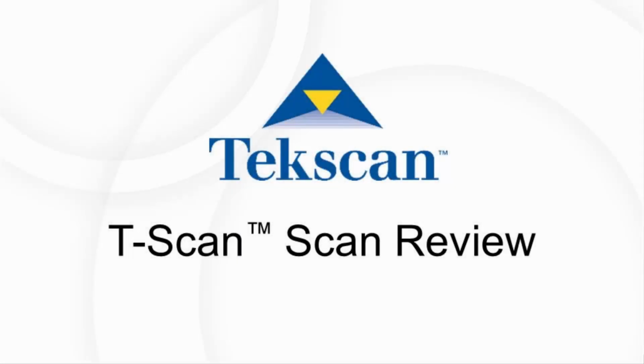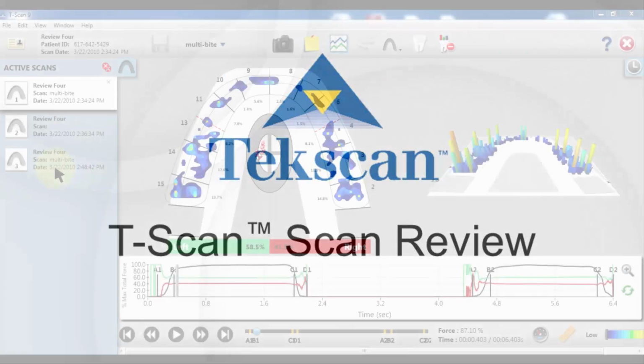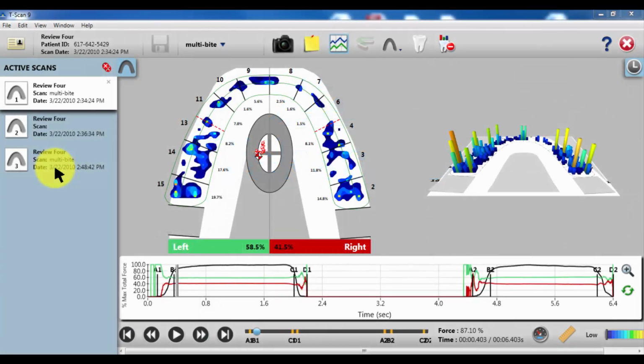In this demonstration of Tekscan scan and review, we're going to go over a slightly different bite than we normally teach. It's called a crunch and grind. The series of videos I have here were done by a local dentist in the Massachusetts area, and he, I would say, developed this process of crunch and grinding using Tekscan to help identify painful teeth.